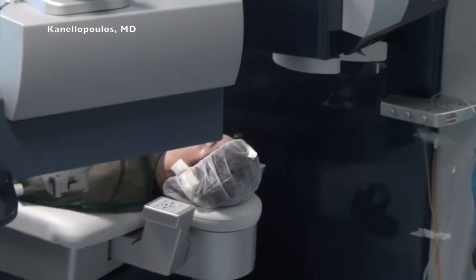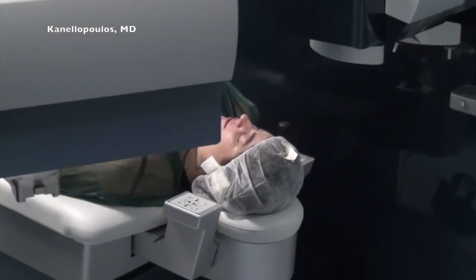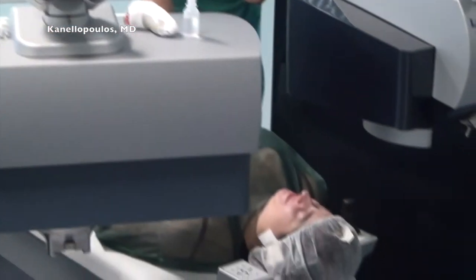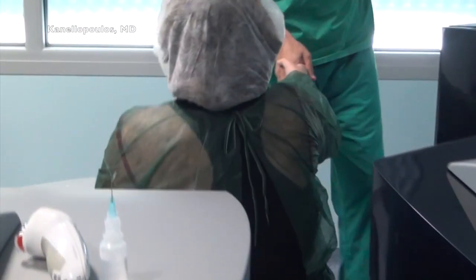So this is our LASIK technique. We're using moxifloxacin and dexamethasone, Vigadexa in the US, 4 times a day, at least for a week. No showering, avoiding washing the eyelids. We only do that in the office. Here we're seeing a different plane of the same procedure.